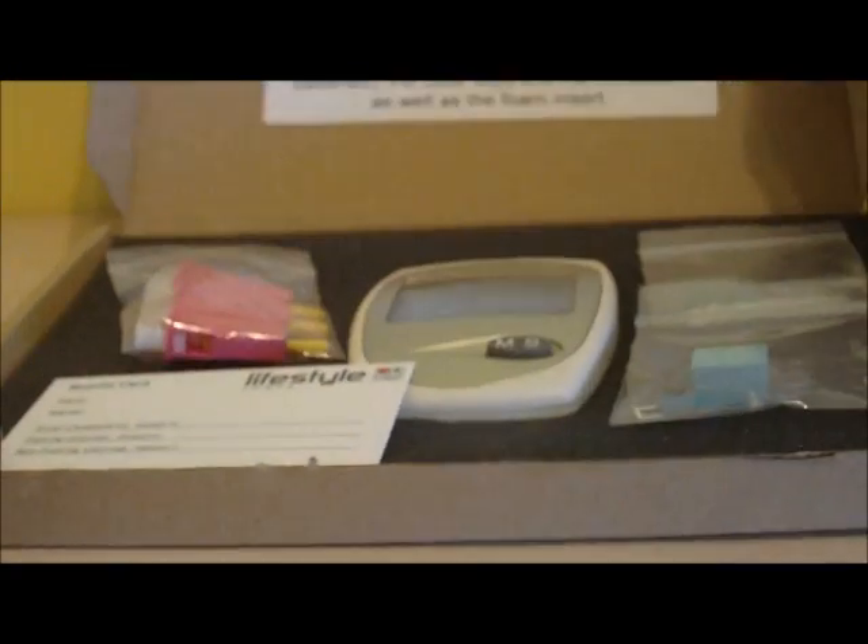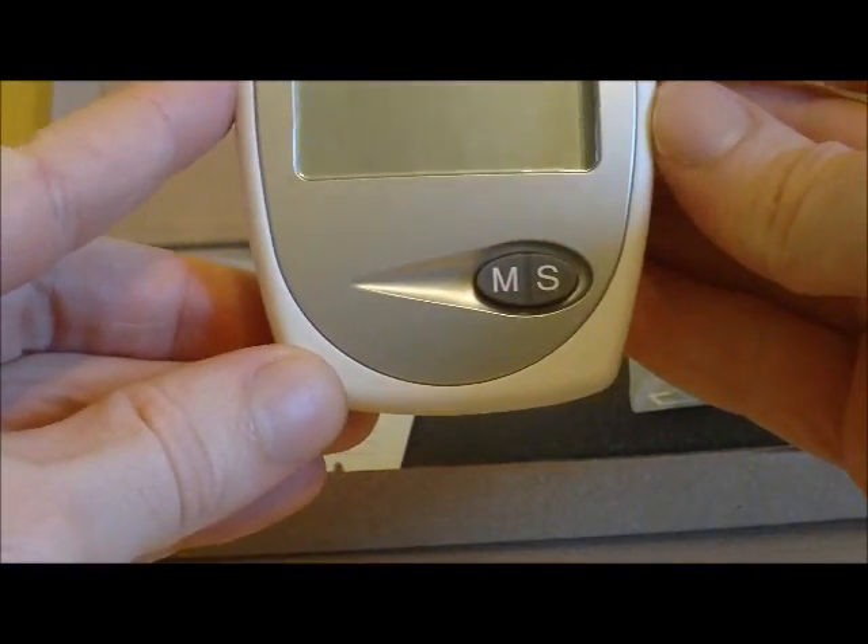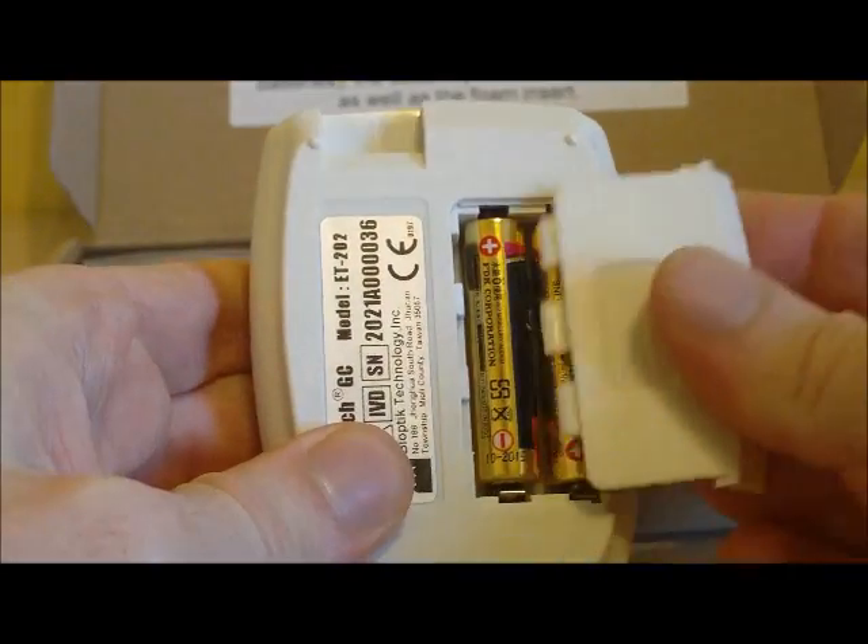This is an online video tutorial showing you how to use your EasyTouch glucose and cholesterol monitor. When you receive your package, it should contain the following items. You should have an EasyTouch glucose and cholesterol monitor, complete with batteries already installed.